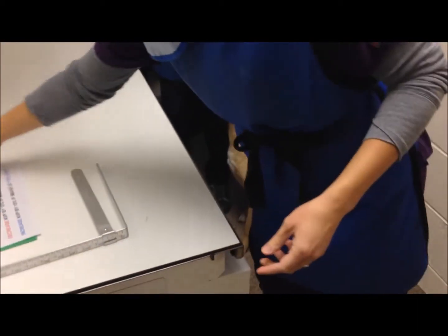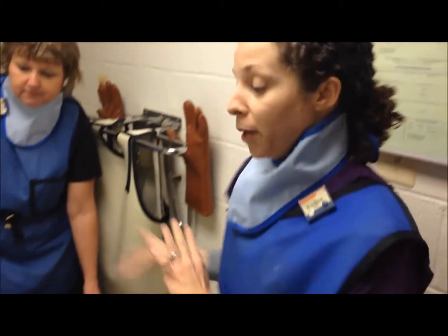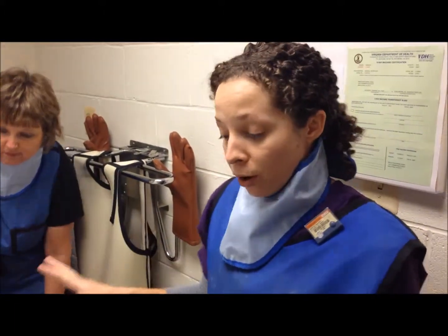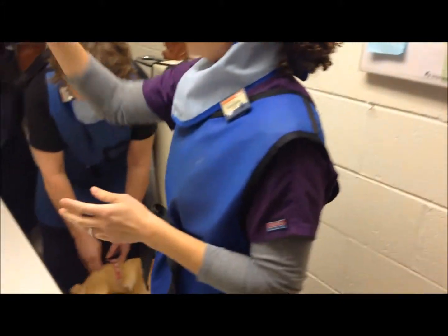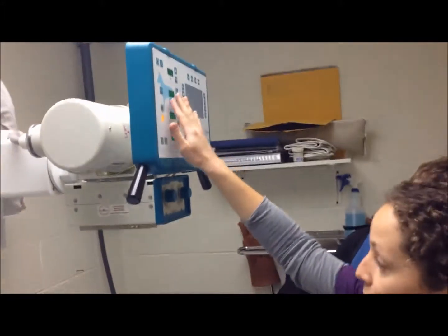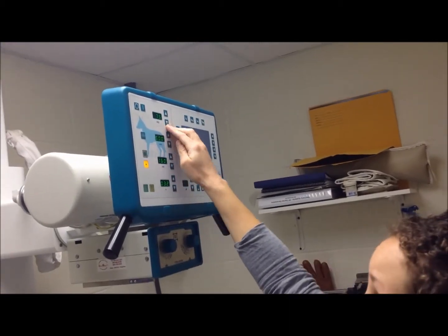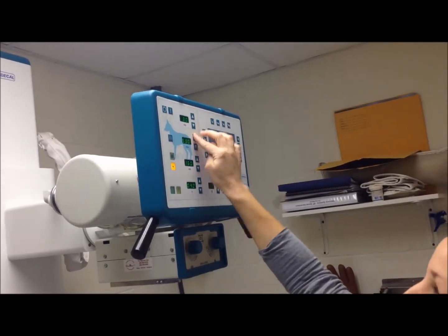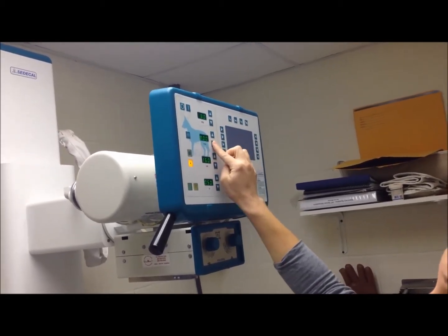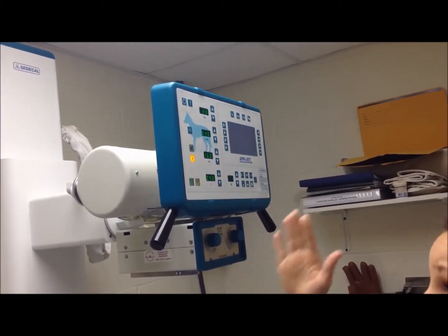And basically, the best rule of thumb when you're doing radiology measurements is that you want to get your patient into position on the table before using your calipers to take the measurement. And we're also going to be setting our machine for the ideal settings, which are 80 kVp and 7.5 mAs. This machine will get to 80, but it goes from either 8 to 6.4. So in this instance, you can pick either one of those because 7.5 is kind of in the mid-range.